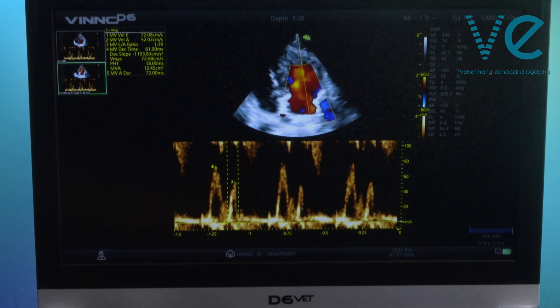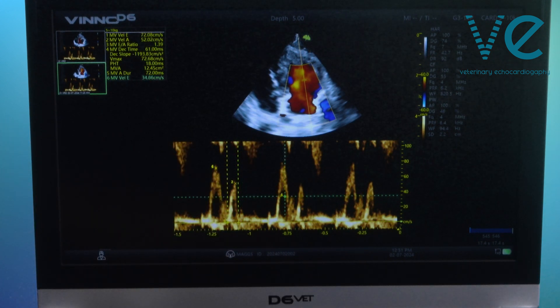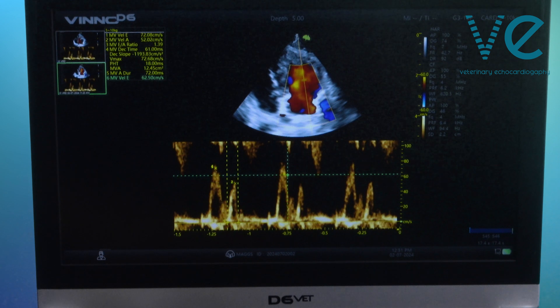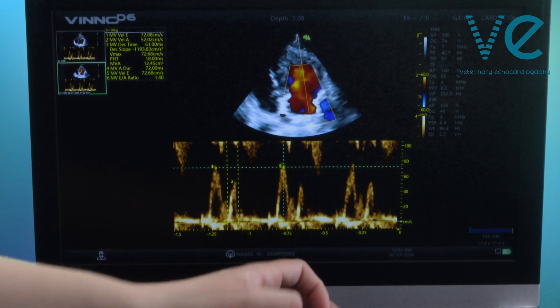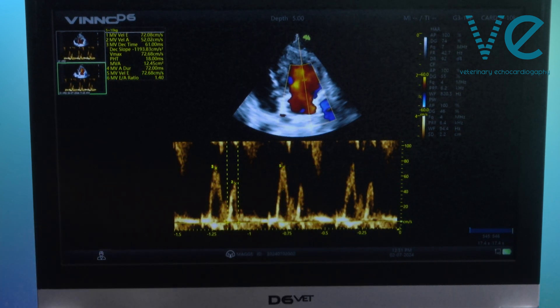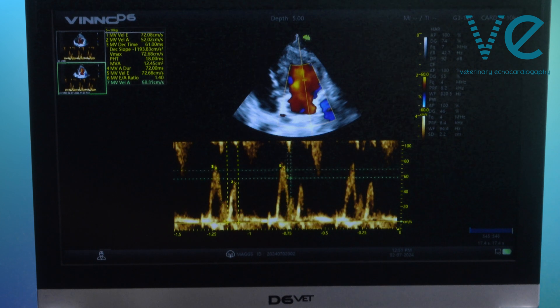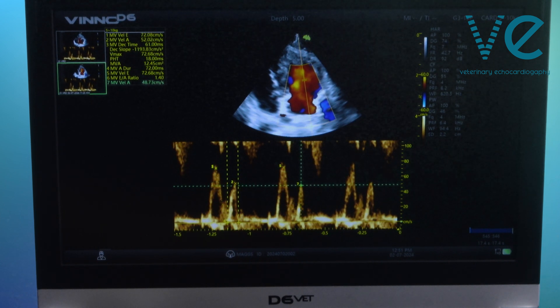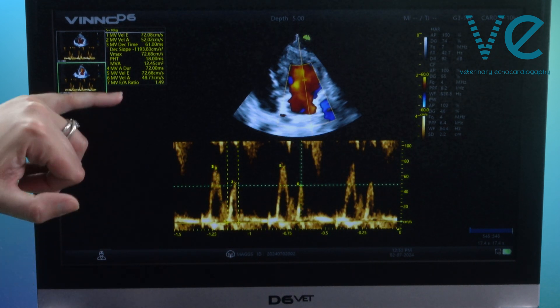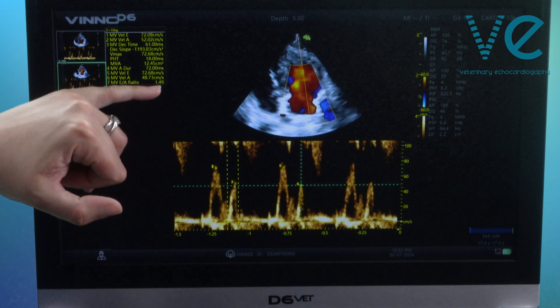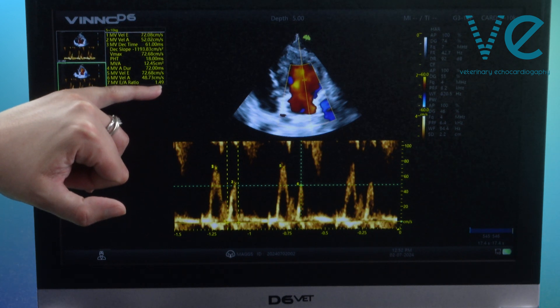So you would go to your peak E and place it at the peak of the E wave, then peak A and place it at the peak of the A wave, and your machine is going to calculate an EA ratio for you.